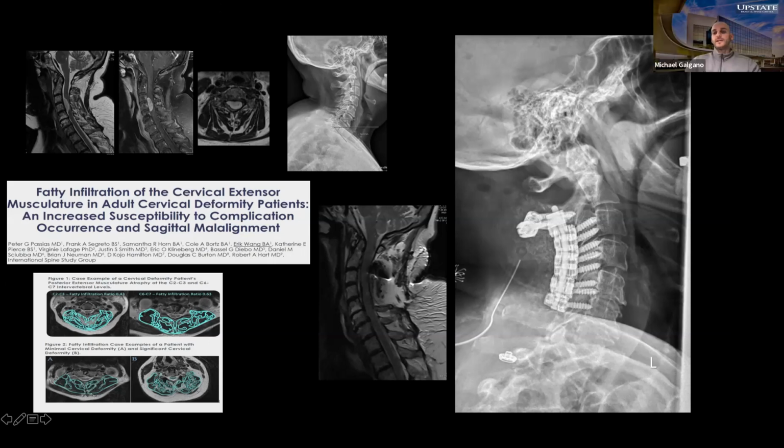The times that I've seen that, Mike, has been when the surgeon is not diligent about keeping that distal LIV+1 interspinous and supraspinous ligament intact. I don't necessarily think, at least anecdotally, that stopping at C6 inherently will make you have distal junctional failure. In the cases I've had in my own practice or that I've revised, it's almost always because the surgeon will place their last screw at the last level of their laminectomy. And if you've done a complete laminectomy at that last level of your last screw, that means you've completely stripped away that intervening ligamentous complex between your LIV and LIV+1. I think that's what puts you at risk of DJK, not necessarily whether you stop at 6 or 7. That's just my anecdotal opinion on it.